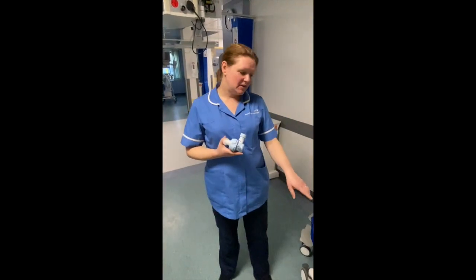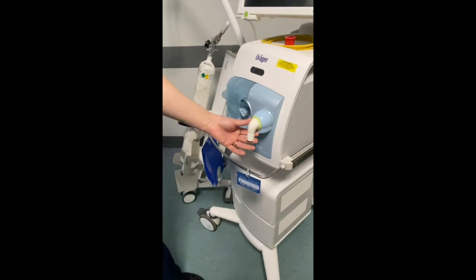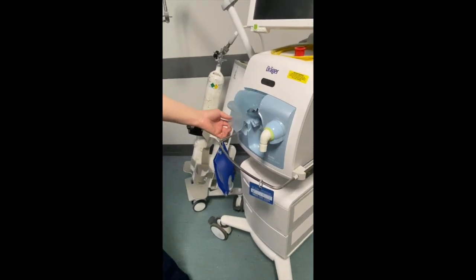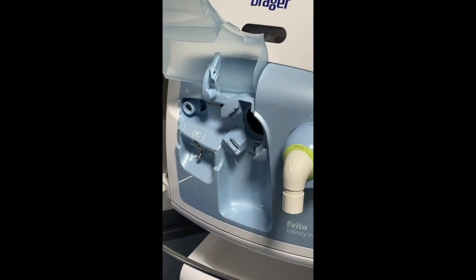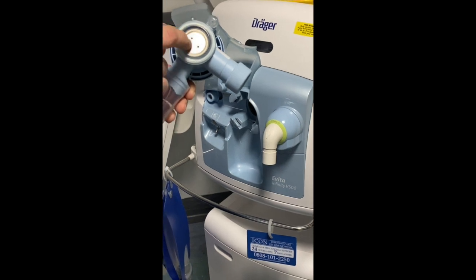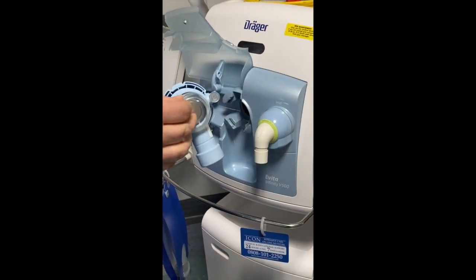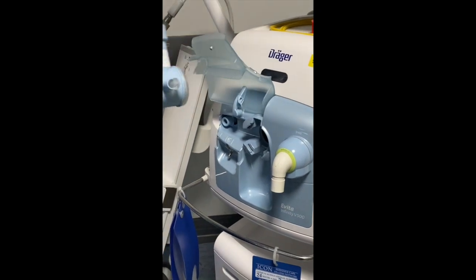On the front of the ventilator, you've got the inspiratory valve here, which is non-disposable. You have this little flap that lifts up, and into this part here you put the expiratory valve. With the expiratory valve, make sure when you've taken it out of the packet that the valve is on the back — if the valve can drop off, it won't work without it. So make sure the valve is in place.